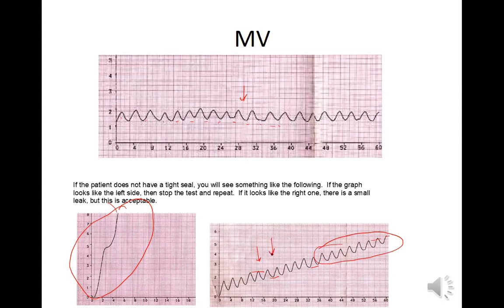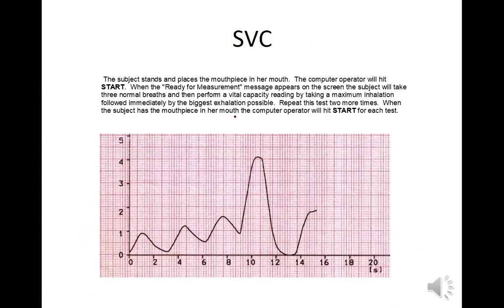So they're both, this is minute volume as well, over a minute, right? Remember, liters per minute now, liters per minute for a minute volume. Liters per minute, really important that you know those units. So far, it was only liters per breath. And basically, when you're putting these tests into the spirometer, everything's going to change by the machine. The machine's going to change everything. Like first, you start with the volumes, the lung capacities, which we already did. That was the TV, the IRV, the ERV, the vital capacity, the total lung capacity, and residual volume. Those are all your basic pulmonary capacity volumes.